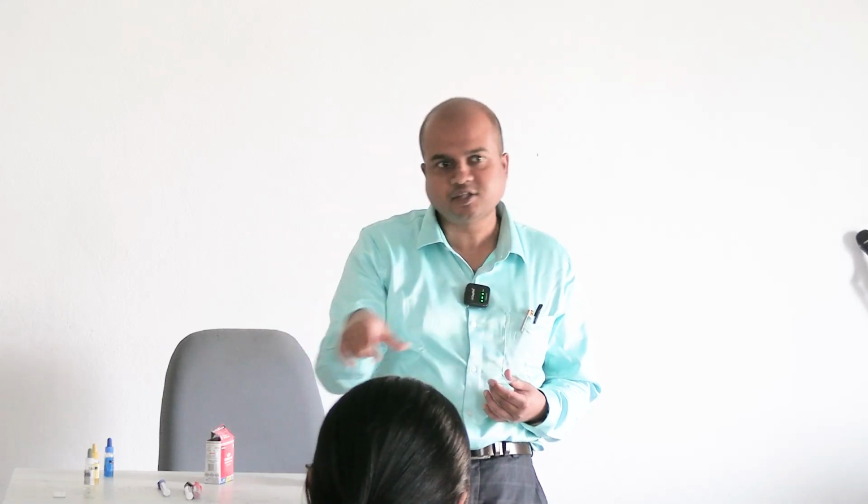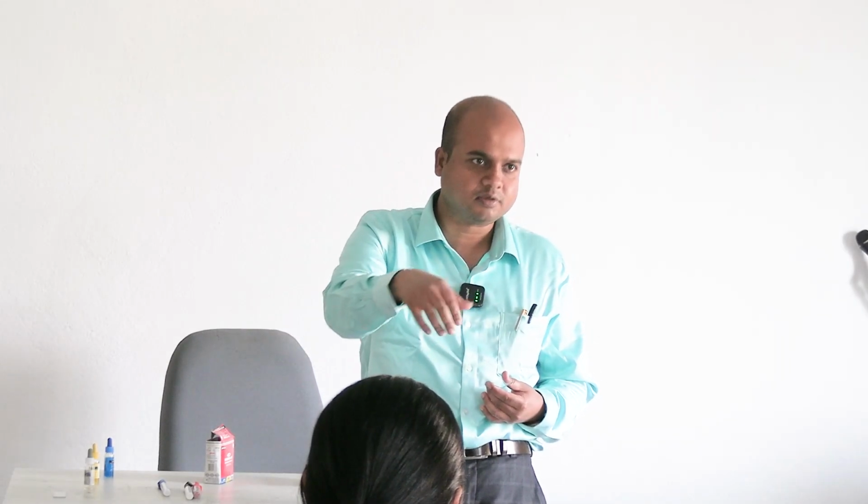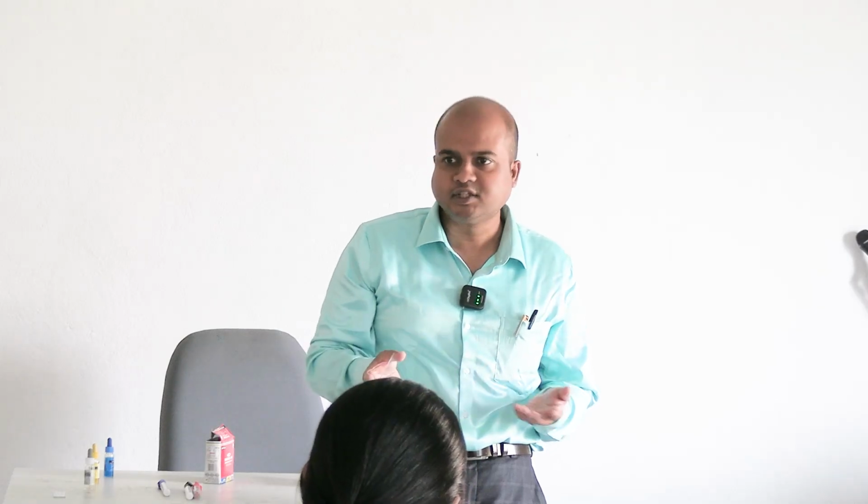If it is not possible, we see it under the microscope. Now, if it is not possible to see with the naked eye, which is very rare, then it is better that we take 3 different slides for the 3 different antisera and note these 3 slides one after another under the microscope, and maybe a 4th slide for the control solution, so that under the microscope it is very clear. So this is very simple, we will just do it in the lab.